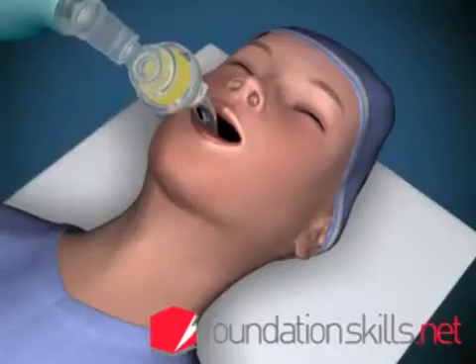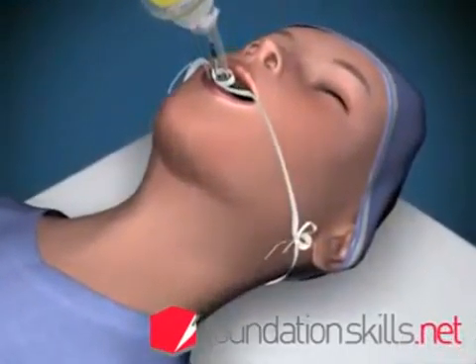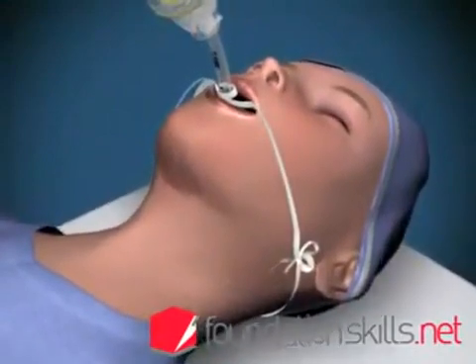When the tube is in the correct position, tie it in place with cotton tape and attach the tube to the ventilating apparatus and ventilate the patient.